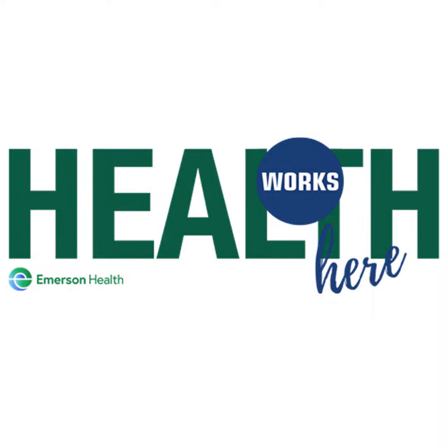Does it make a difference in the long run? Robotics has only been around for about 12 years, and so we don't know at 30 years if it is going to improve the outcomes, but we know that patients tend to recover quicker, have less pain, and we're putting the implants exactly where we want them. I can't imagine a world where you're putting implants in less precisely and getting a better outcome. And the main downside to robotics is really that there is a little bit of increase in the cost of the procedure, but in my mind, the long-term benefits of putting in the implants exactly where you want them outweigh any costs.